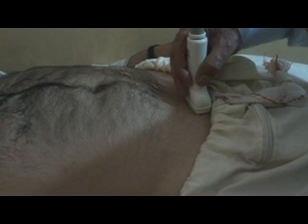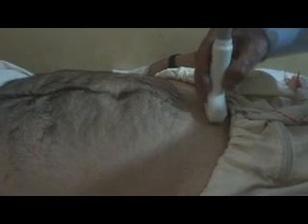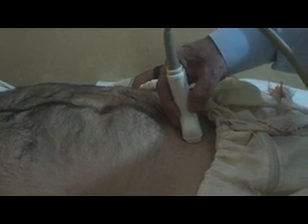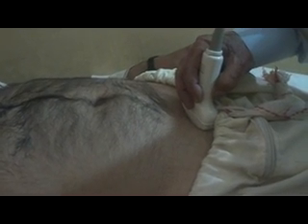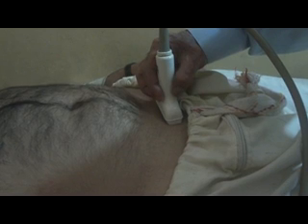I have placed the probe suprapubically in a transverse location and then I will move the probe downwards — further downwards — to get the urinary bladder. Going a little caudally I will get the seminal vesicles, and going slightly more caudally I will get the prostate in transverse section. Then I will rotate the probe 90 degrees, come into the longitudinal section, apply a little pressure, angle it downwards and towards the patient's left side. This manoeuvring will help to get the prostate in longitudinal section.